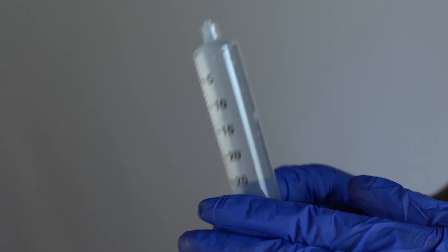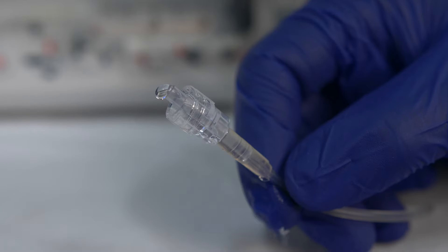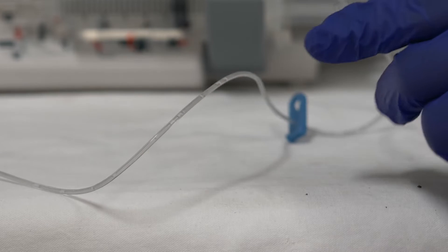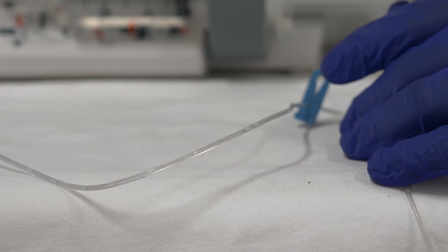The syringe and extension line must be filled or primed with fluid before it is connected to the patient. Air in the line is extremely dangerous to the patient. If air bubbles remain in the line, the patient would be injected with that air, which may cause an air embolism.